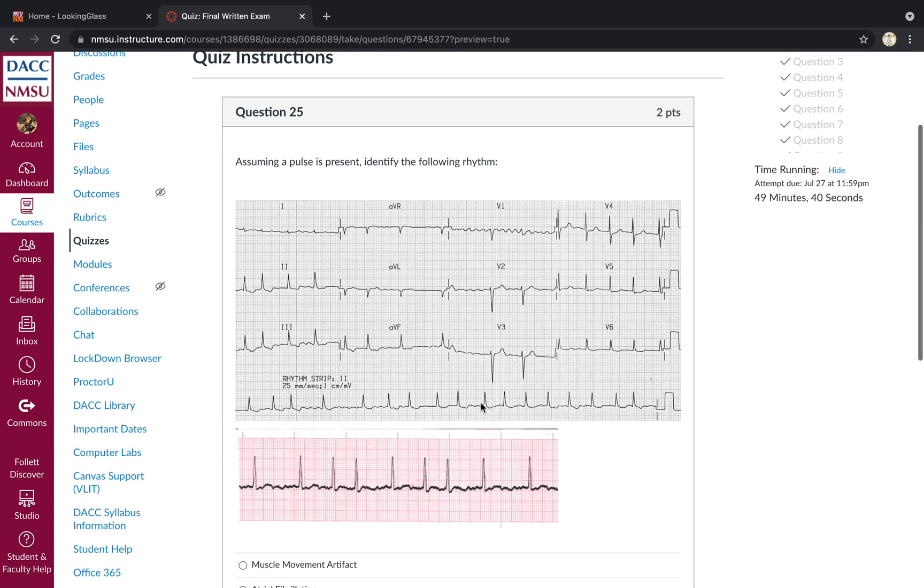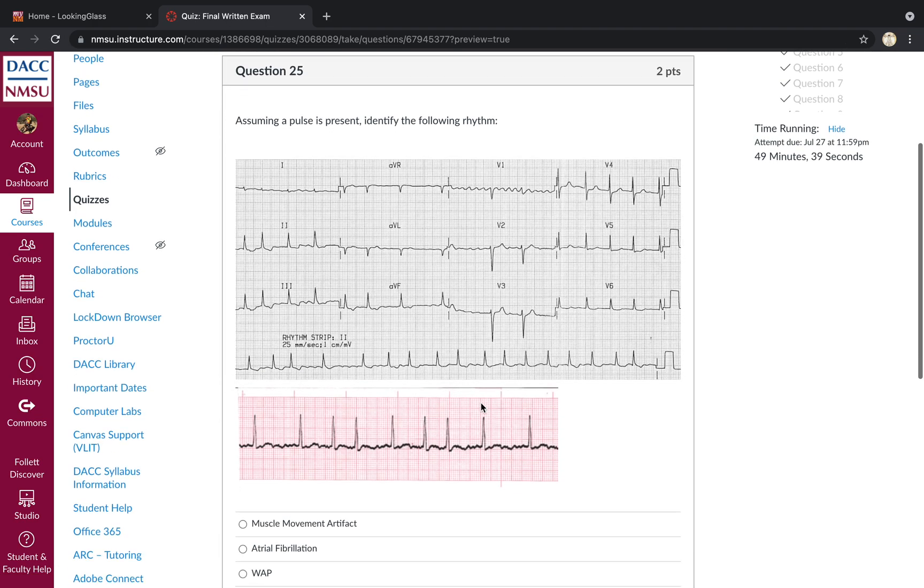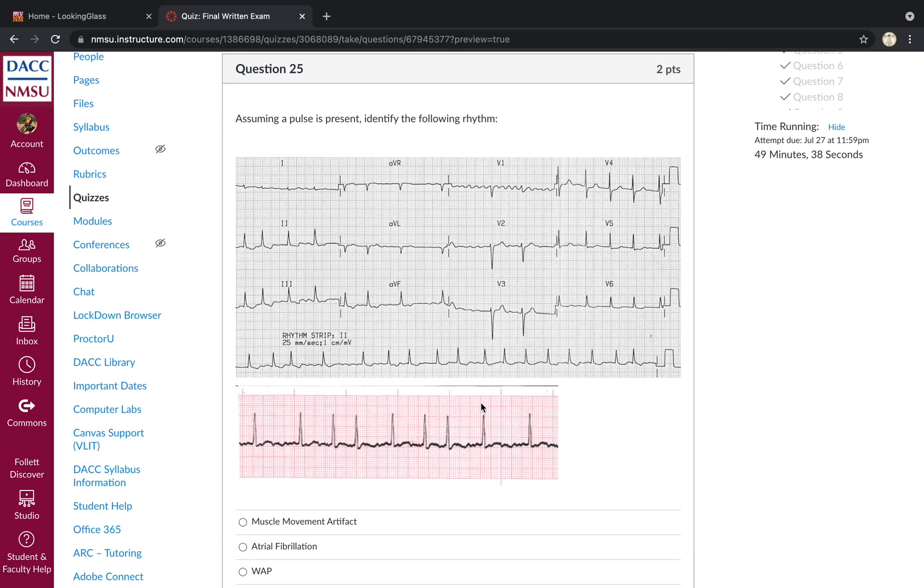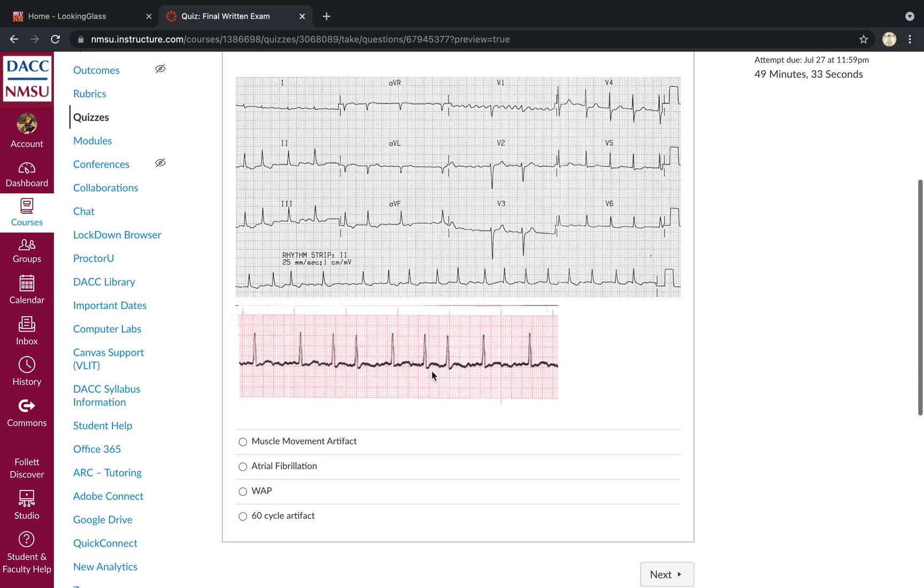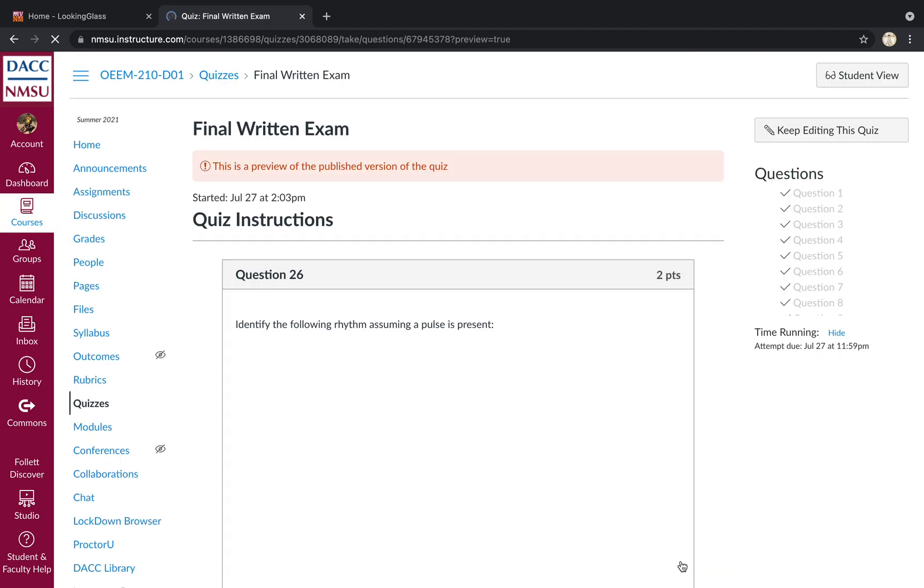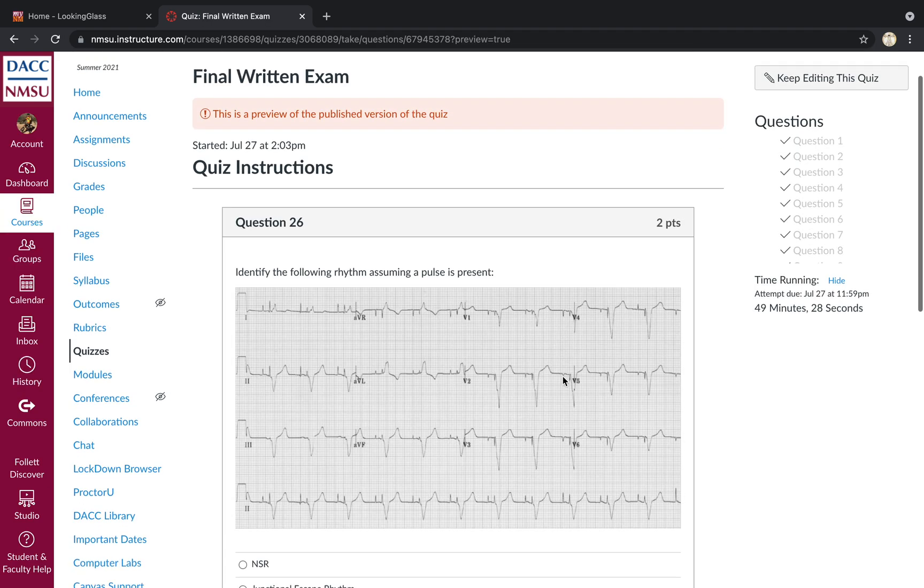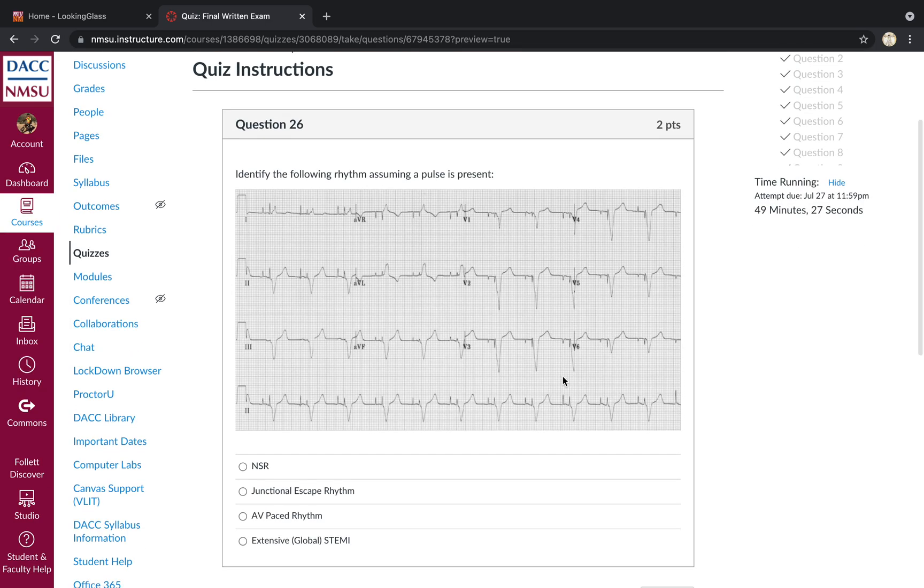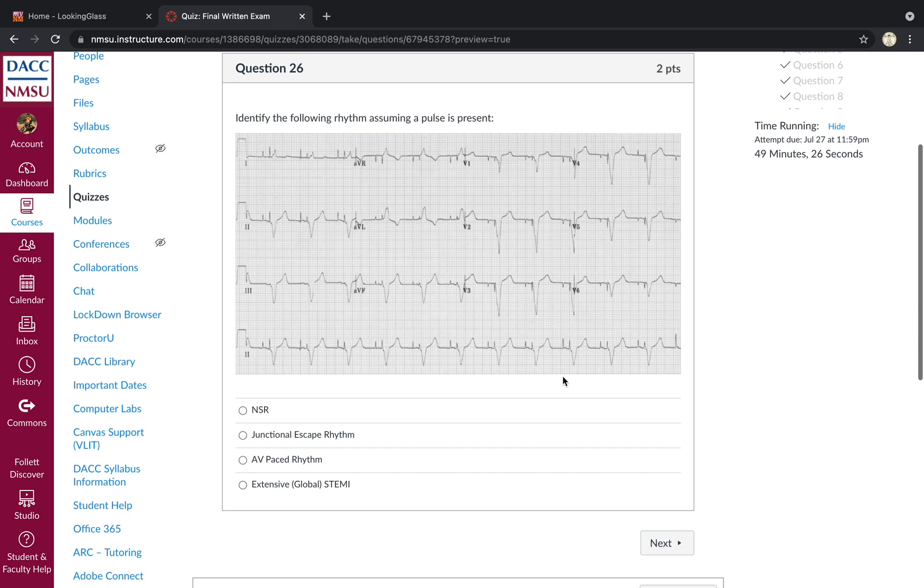Assuming a pulse is present, identify the following rhythm. It's irregularly irregular. You've got a chaotic wandering irregular baseline. Here's a rhythm strip at the bottom. Atrial fibrillation is the best answer there. Identify the following rhythm. Assuming a pulse is present, you've got pacer spikes. It looks like you've got both atrial and ventricular spikes. So that's AV sequential pacing. So AV paced rhythm.